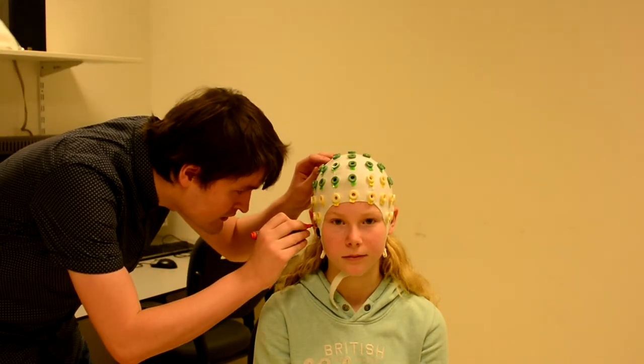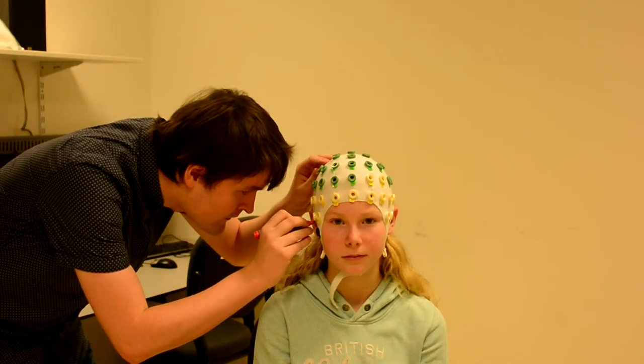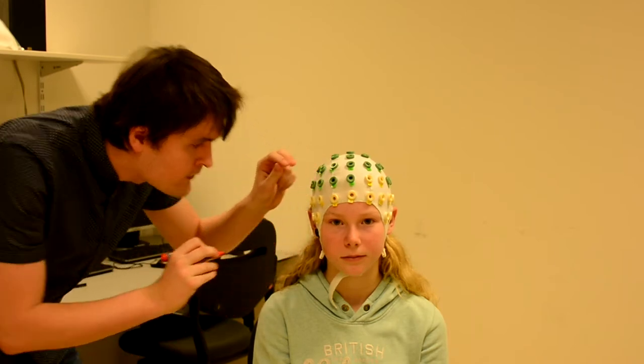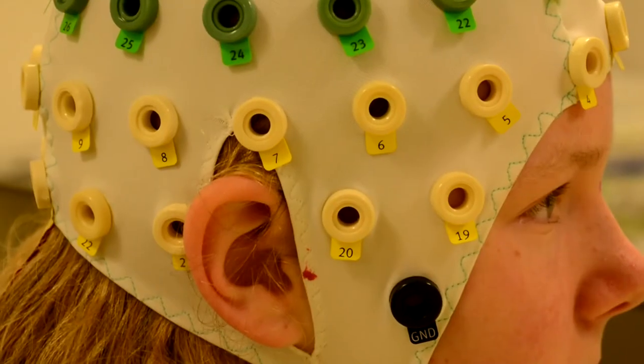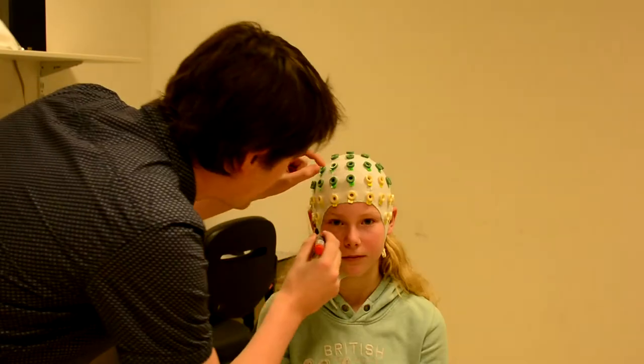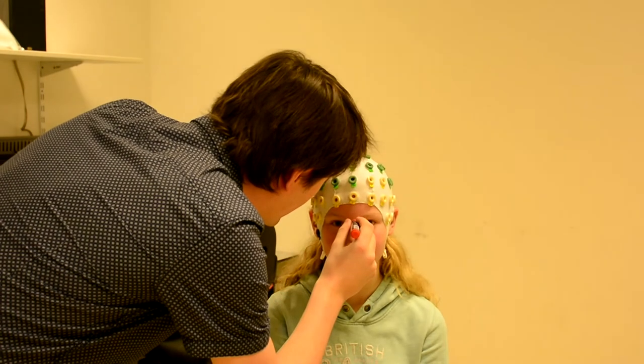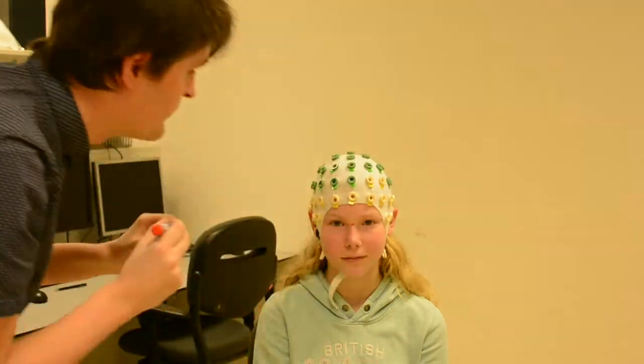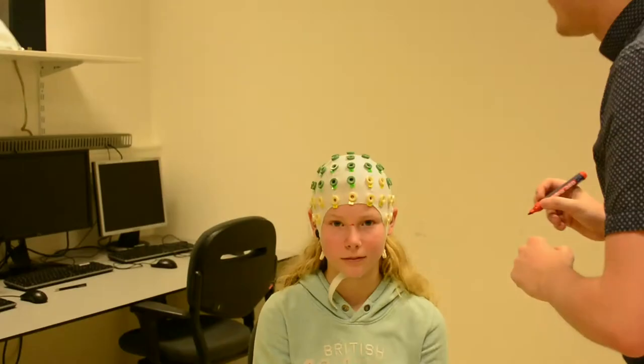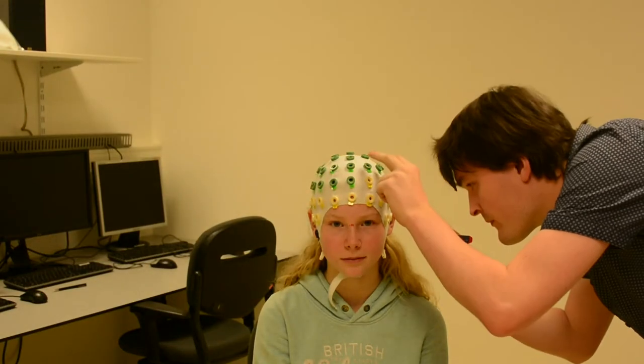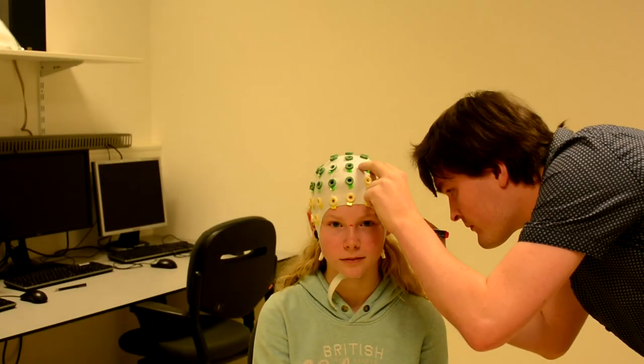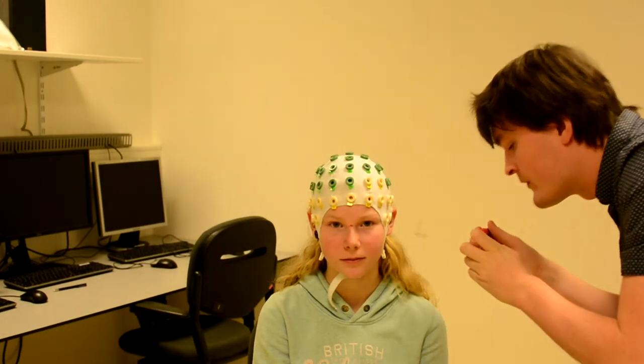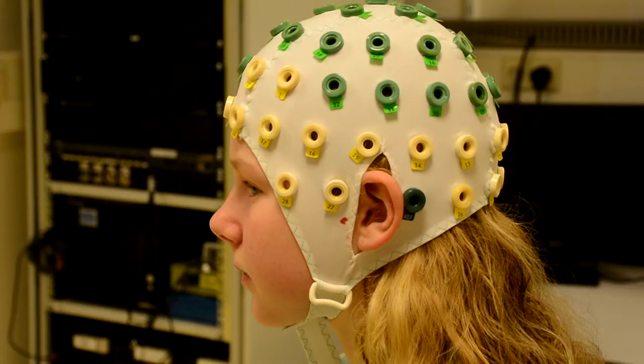First of all, we have to prepare the subject. We will firstly mark the fiducials on the right ear. Then we go to the nose, mark between the cavity on the upper part of the nose. And then we go to the other ear and mark again the fiducial.